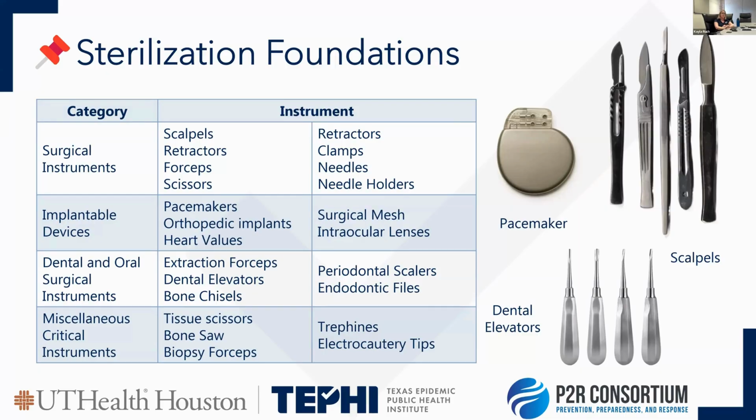And then other types of miscellaneous instruments, depending on what type of surgery you're doing or the patient population that you see specifically in your organization.